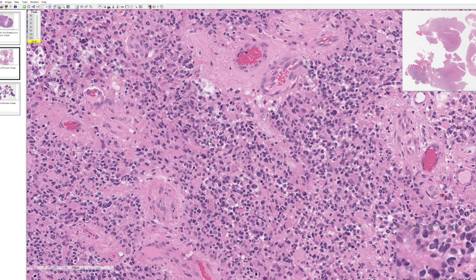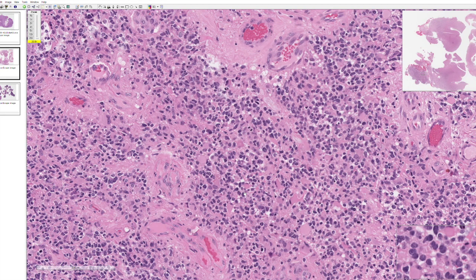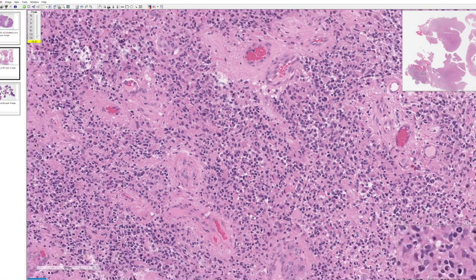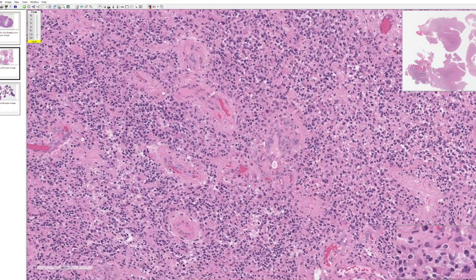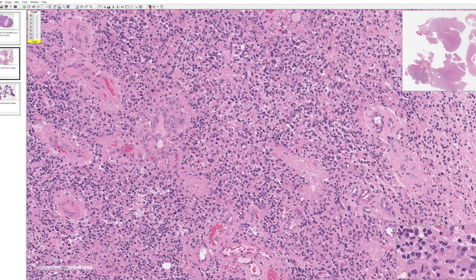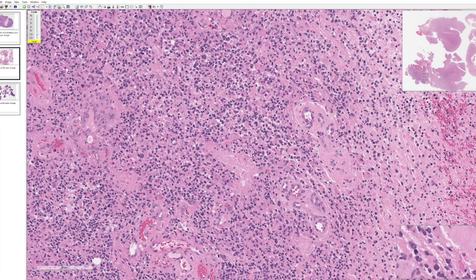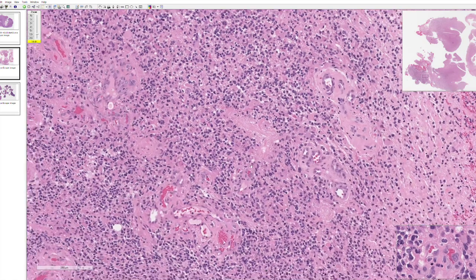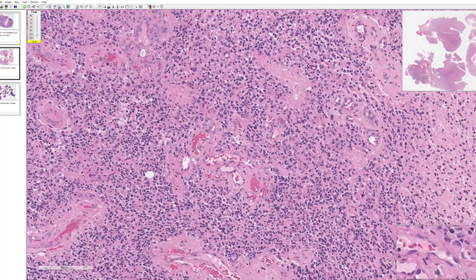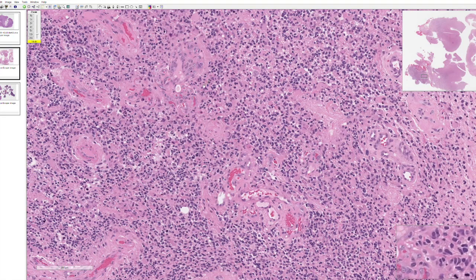Now, given that that mechanism of therapy didn't work, people looked around for other biological features that were consistent in these tumors to try to overcome the resistance to these cytotoxic agents. And one of the key features that was common in all glioblastomas is this feature of microvascular proliferation. You see these very large, dilated, multi-luminal blood vessels here, which is a very common feature of this tumor.